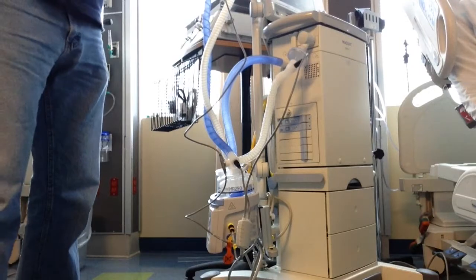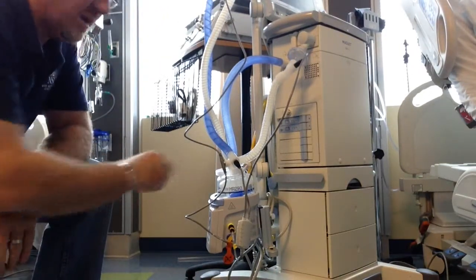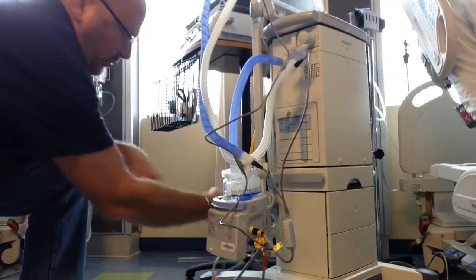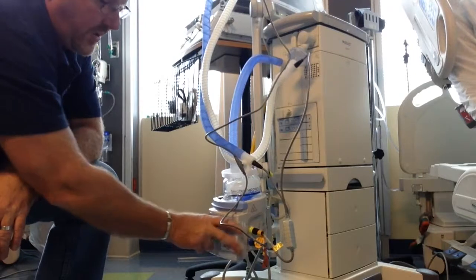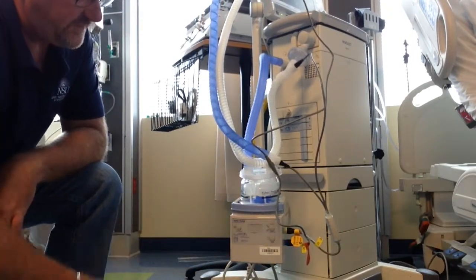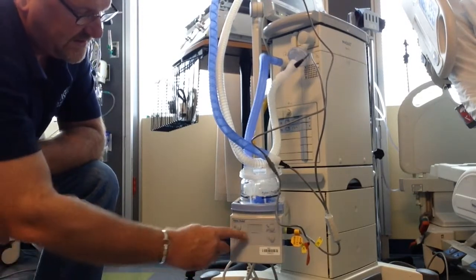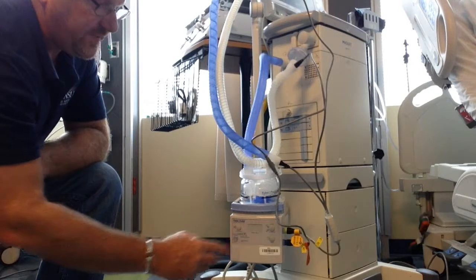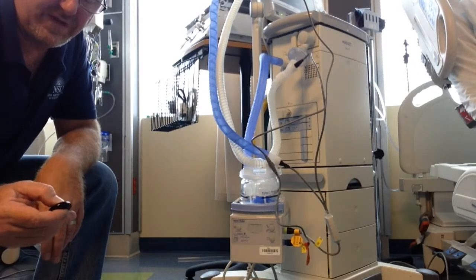I am now ready to provide heated humidification to my patient. Once I spike my bag and have water going in, it also needs to be plugged into the wall. You plug it in and you have your options right here — invasive or non-invasive; it'll default to invasive. You turn it on and off here, and here's your alarm silence. This diagram will light up wherever the error is. And that is how to set up a heated humidification system.